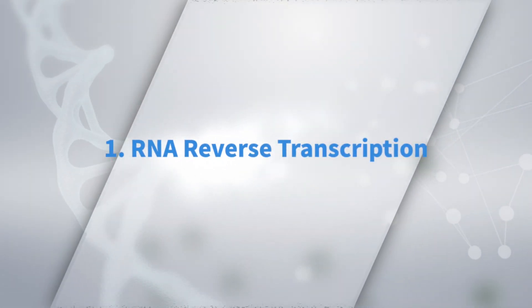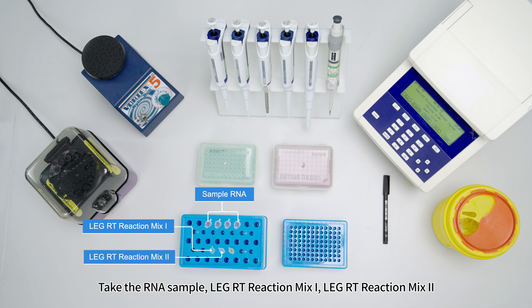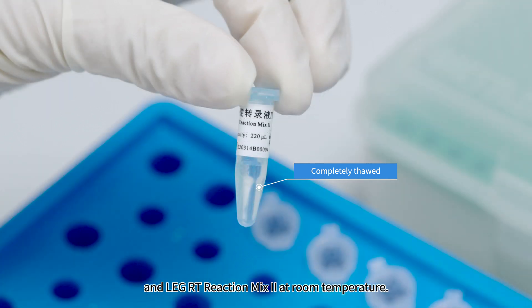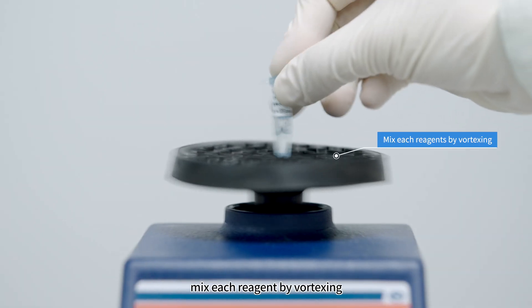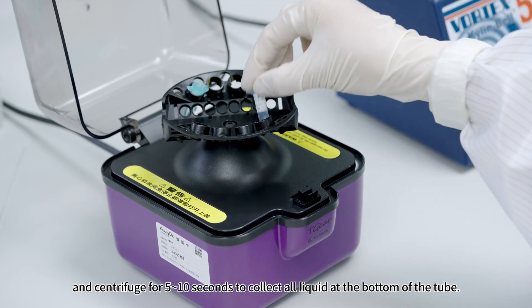For RNA Reverse Transcription, take the RNA sample, LEG-RT Reaction Mix 1, LEG-RT Reaction Mix 2, and LEG Reverse Transcriptase out of the freezer. Leave other reagents in the freezer at minus 20 plus or minus 5 degrees Celsius. Thaw LEG-RT Reaction Mix 1 and 2 at room temperature. When completely thawed, vortex each reagent and centrifuge for 5 to 10 seconds to collect all liquid at the bottom of the tube.